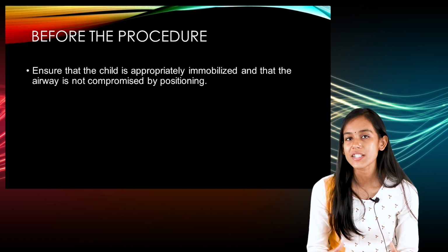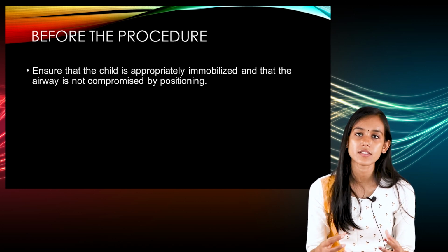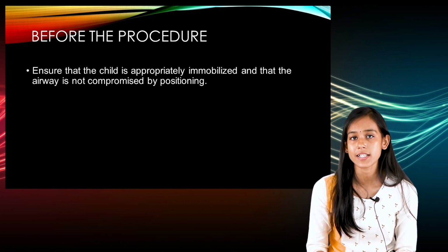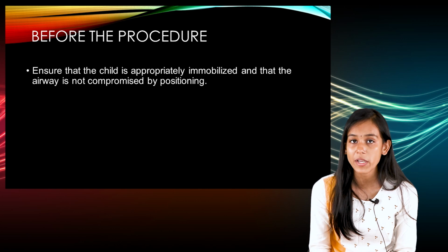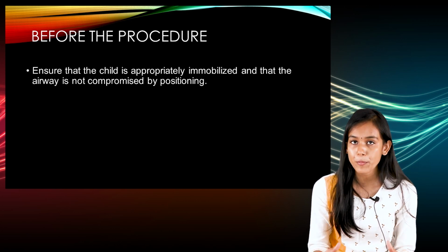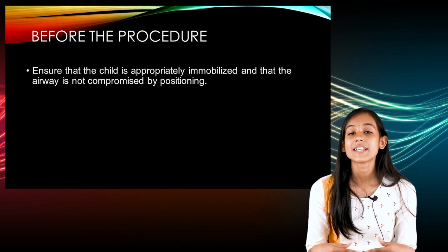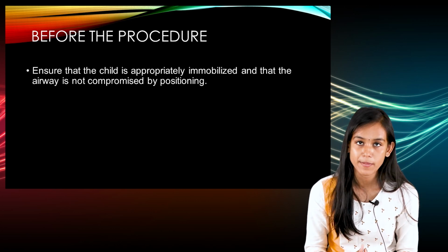So once you expose this insertion site, the next thing that you have to make sure is that the child is properly immobilized, and that the airway is not compromised by the positioning.